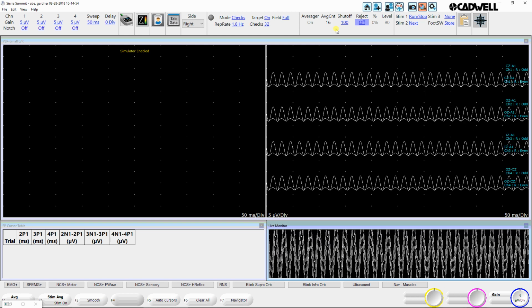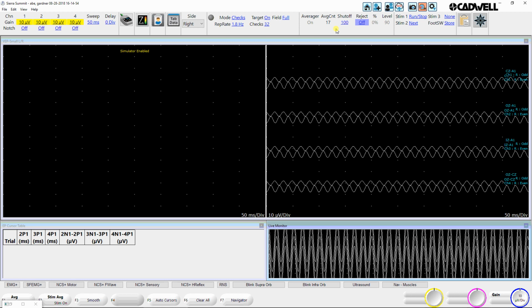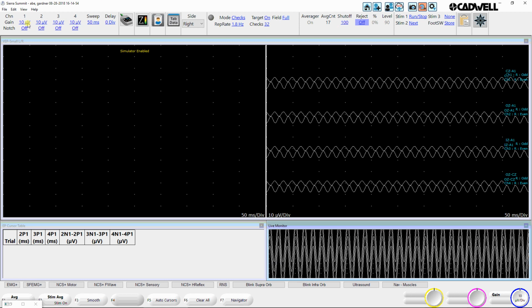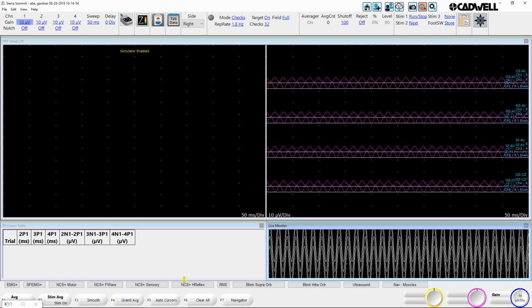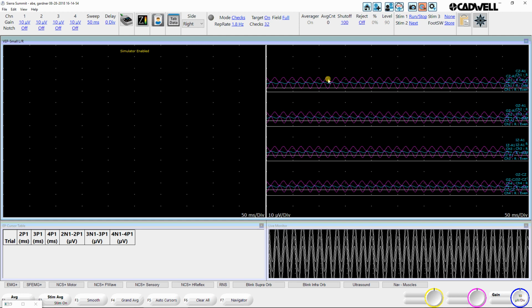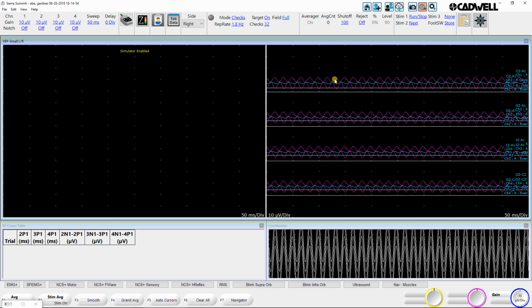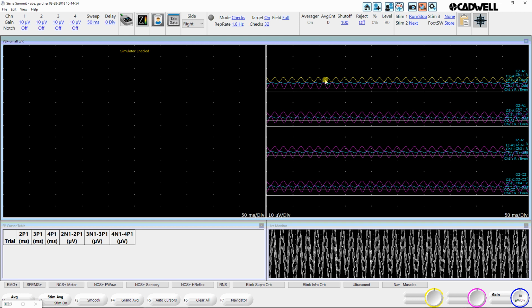When I'm satisfied with the responses, I can stop. Again, your blue knob is your gain, or you can change individual gains by clicking here on the individual channels. We'll store this response, and then we'll push F4 for grand average, and then we will drag these guys out of the way. If you want to adjust an individual gain, just click on that channel or that trace so it highlights, and then change your blue knob.